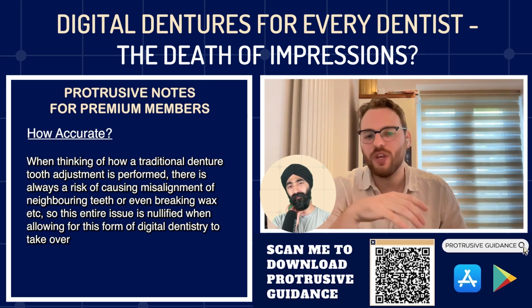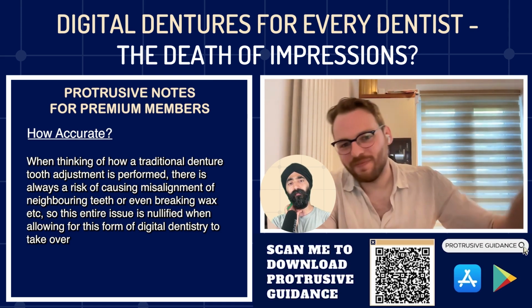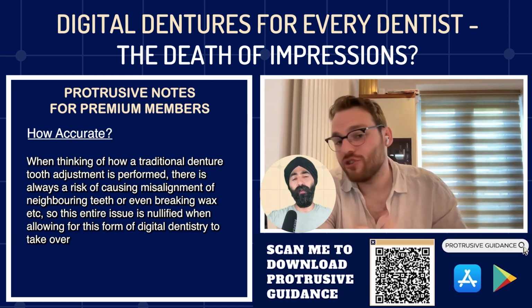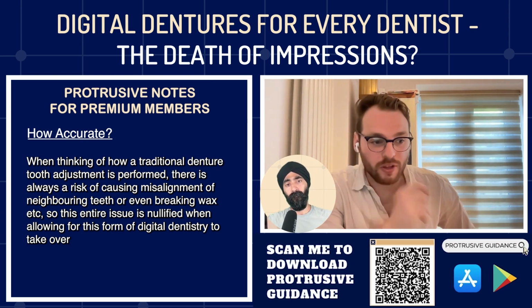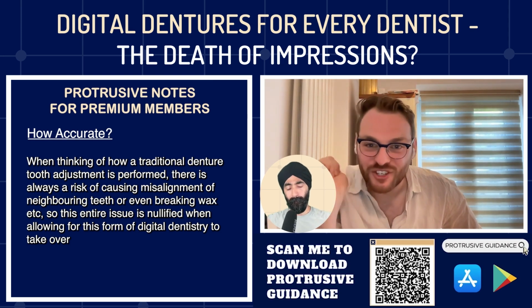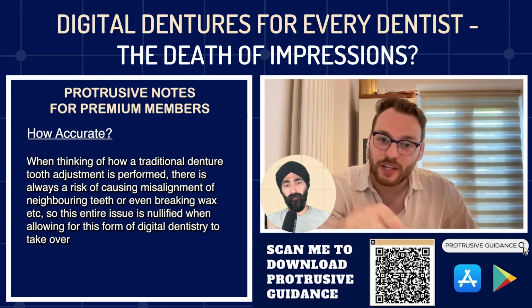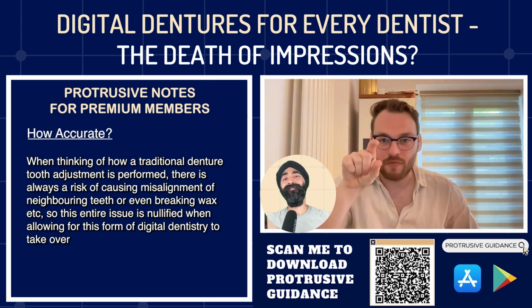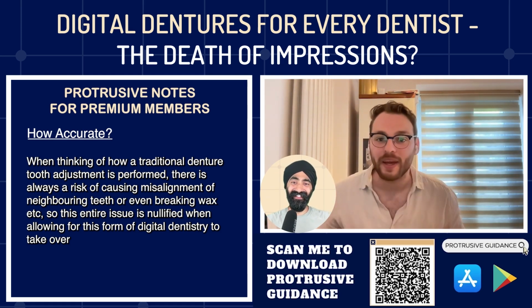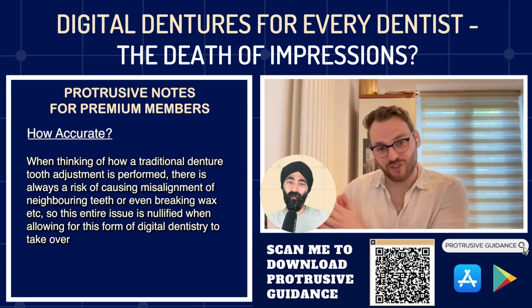So it's a little tricky when you've got macro changes to make. Like you've got the incisal length too long and you need to lop off 2 millimeters. You could just drill it off, exactly. So that's what I've done on one of the cases we show, where I just got a Sharpie out, scribbled on the incisal edge until the patient was happy, and drilled off one side so the technician can measure it. But then when they go back in, they just chain the teeth together, link them together, and go, right, move up 2 mil, job done. And they're not sat there for 45 minutes moving all the teeth up and then dialing the occlusion back in. It does it for them. So it's a little bit trickier chairside, but actually for the technician doing those changes, it's easier.